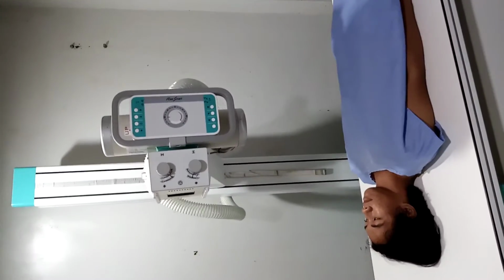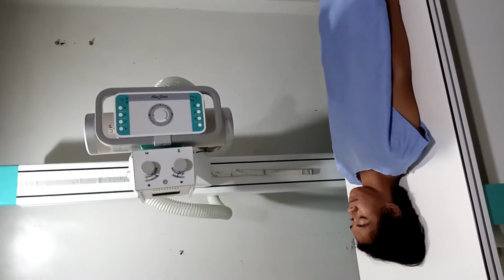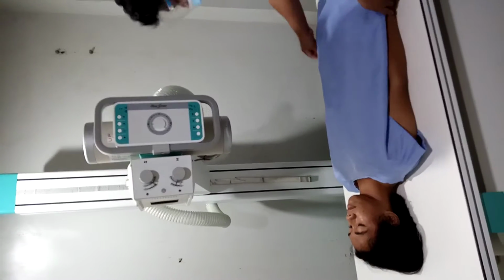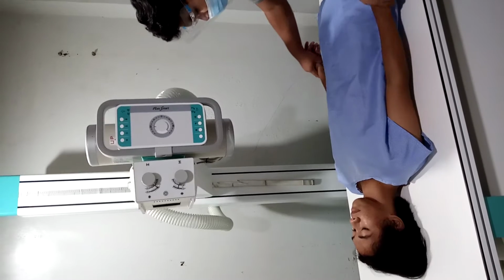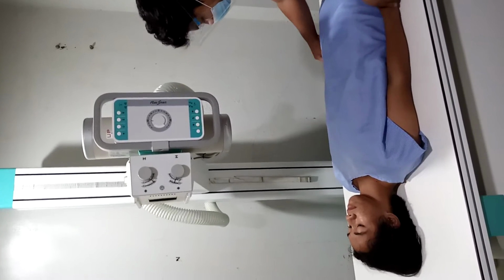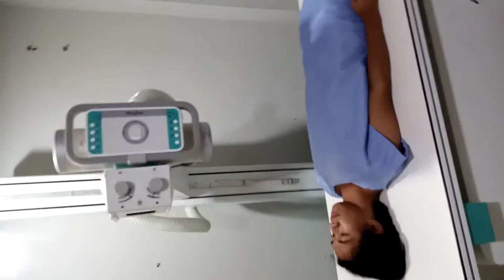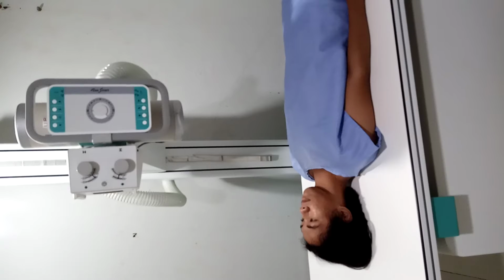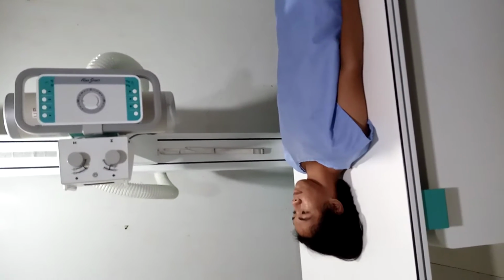Then have the patient hold arms at side and shoulders in the same place. So make sure that the arms are on the sides of the patient. The next one is flex the hips and knees to reduce dorsal kyphosis. So flex.